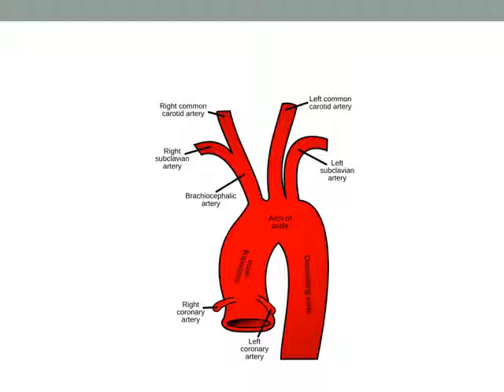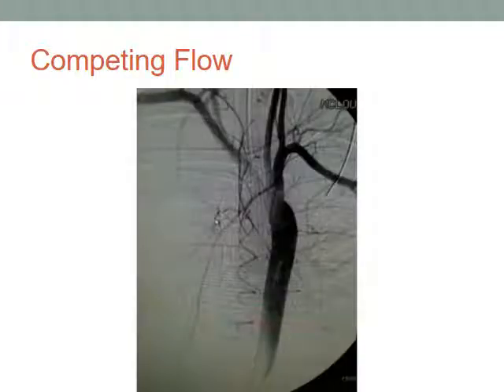This is an aortogram shot from below in a patient who's on VA ECMO. So down low, this is the aorta, and blood is going up the aorta. We see left-sided structures, and here's the brachiocephalic. But where's the heart and the first part of the arch? The reason you don't see that is because the patient's ejecting blood. So blood is coming out of the heart, bathing itself in coronaries, coming up, and it actually runs into, not a brick wall, but a blood wall. It is running into the blood coming out of the ECMO circuit.